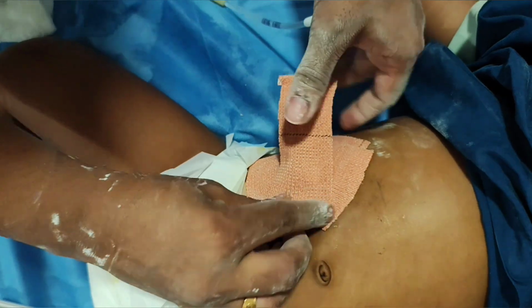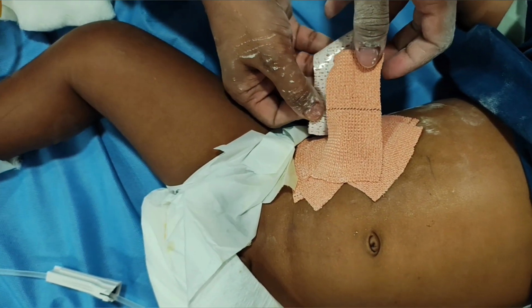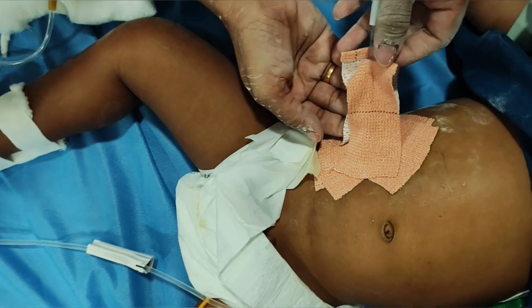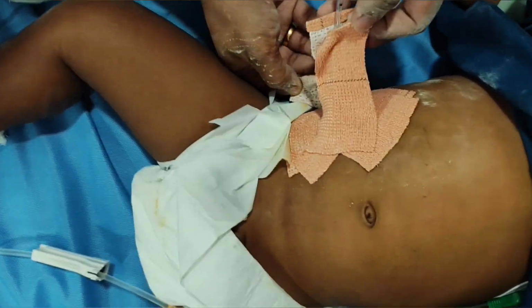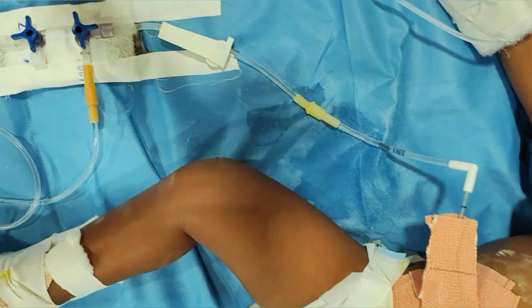Now PD cycles are carried out with a dialysis volume of 10 to 20 ml per kg with a dwell time of 30 to 40 minutes, fill time taking 5 to 10 minutes, and drain time 10 minutes. Total duration of the cycle is around 60 minutes.